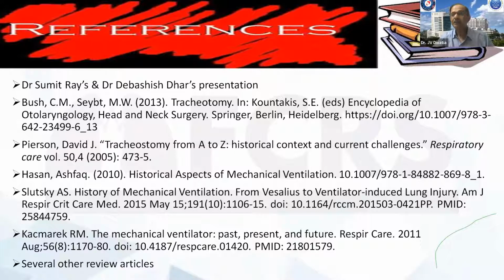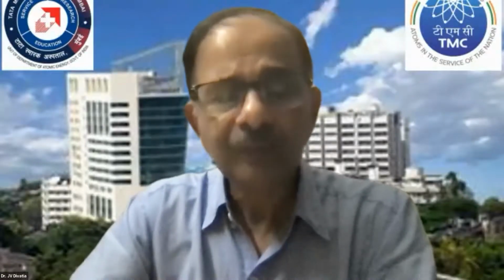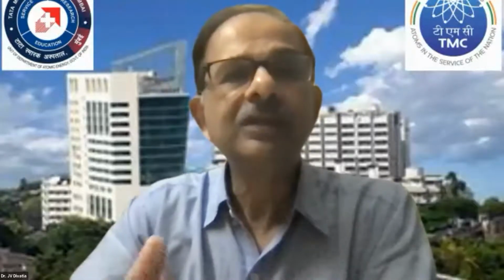And you mentioned what the future is, and the future is probably going to be more towards lung protection. Negative pressure ventilation, there is some rekindling of interest, like you pointed out, but there is also a lot of interest in developing extracorporeal technology so that you rest the lungs and don't damage them by more ventilation, whether it's negative pressure or positive pressure. So it's going to be very interesting to see how biology and the progress of ventilation, rather than the ventilator, progresses.